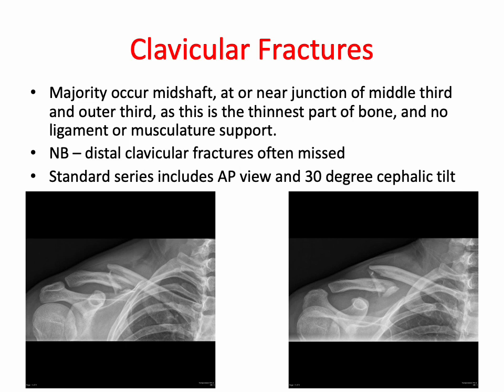The standard clavicular series includes a frontal and a 30-degree up tilt projection. And it's important to not only report on normal things like location, angulation, comminution and degree of overlap, but to take a careful look at the acromioclavicular joints and sternoclavicular joints. Usually it's treated with immobilization, but indications for open fixation would be if there's skin compromise or tenting, neurovascular injury, or significant displacement.